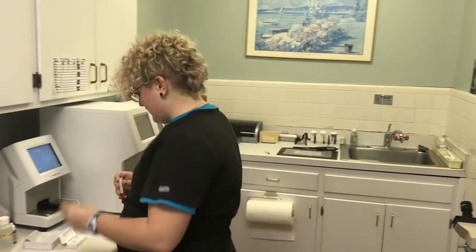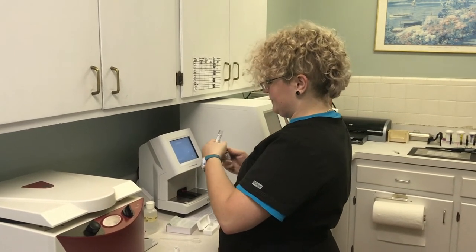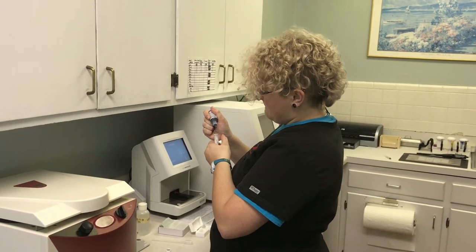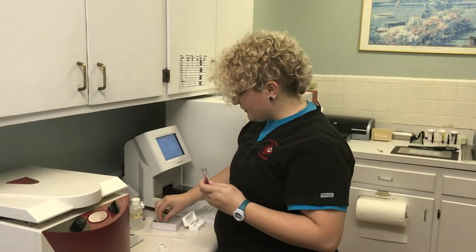Afterwards, I'm going to go ahead and put one drop of the methylene blue stain. And then I'm going to grab myself a glass slide.